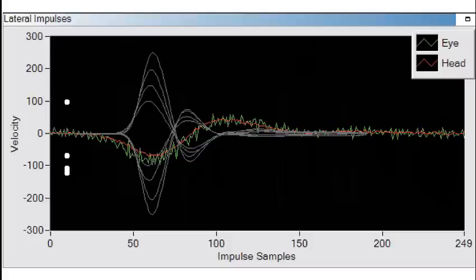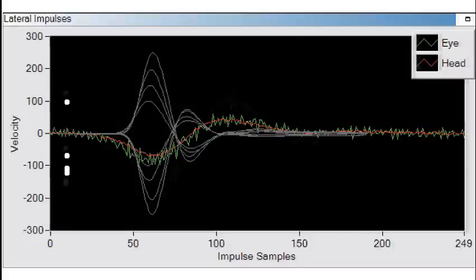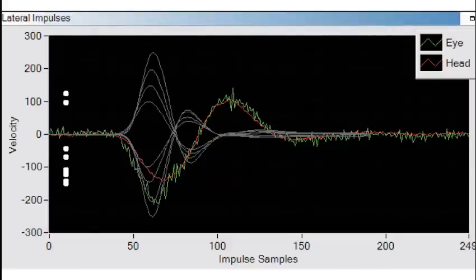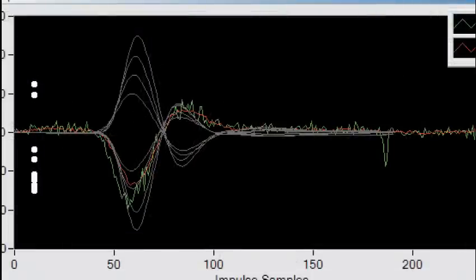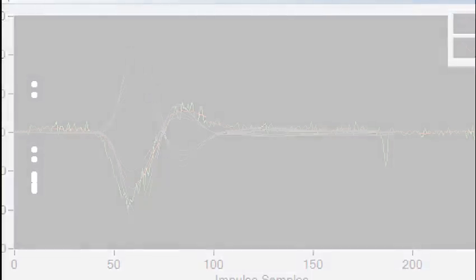In this second example, the head impulse was performed at the correct speed, but the return was too quick. After performing the head impulse, you need to hold it there for a few seconds and then slowly bring the head back to the straight position.